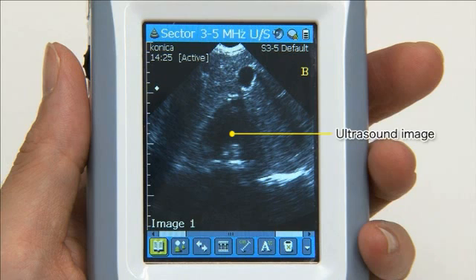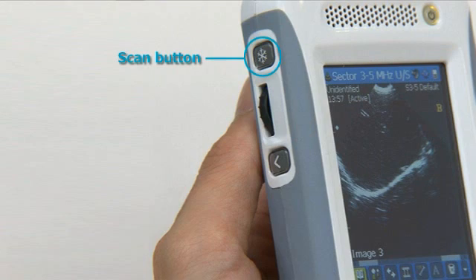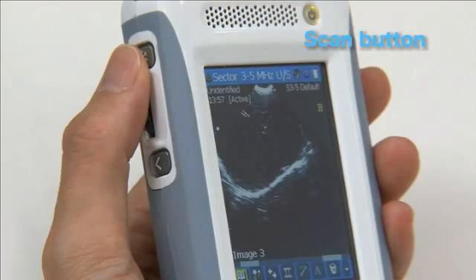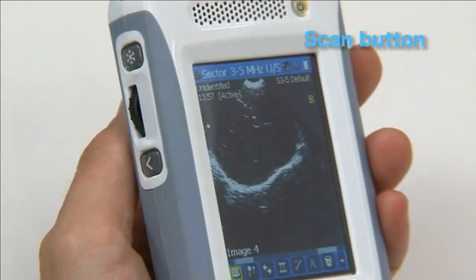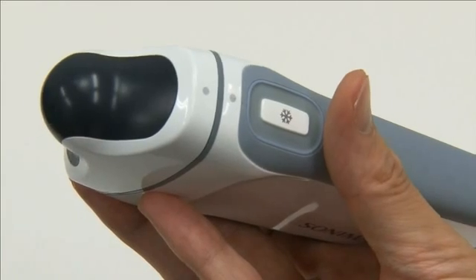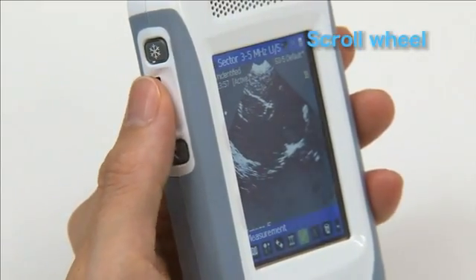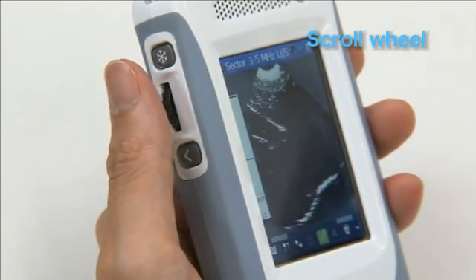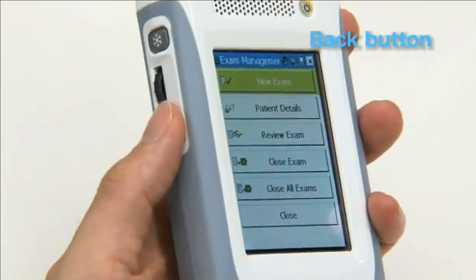The ultrasound image, menu icons, the patient name, and the orientation of the probe appear in the display. A scan button, scroll wheel, and back button are mounted on the side of the display unit. The scan button incorporates a freeze feature that starts and stops the image scan. The probe unit is also equipped with a scan button. The scroll wheel can be scrolled or clicked to adjust the user interface operations and adjust the screen in each mode.